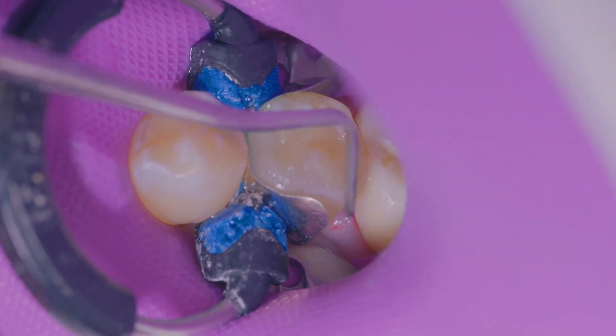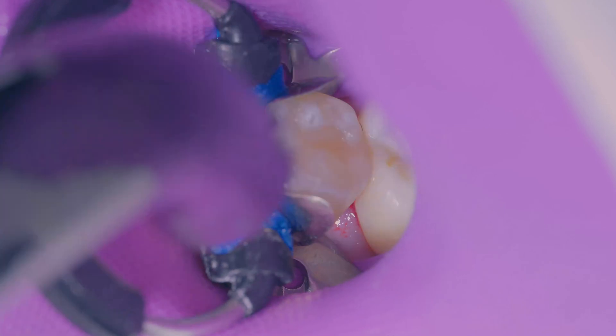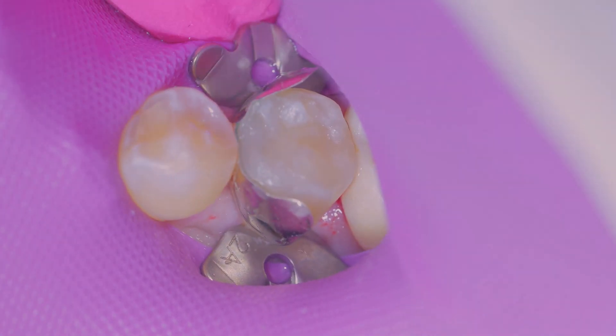One thing I noticed right away was how easy it was to achieve a nice gloss and just how great the handling was. I've been a big fan of Kerr's harmonized composite, and the Simply Shade bulk fill composite utilizes the same adaptive response technology, which truly allows for exceptional blending and ease of sculpting and handling.